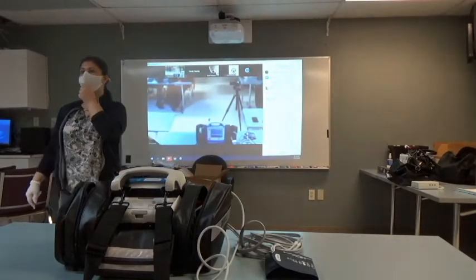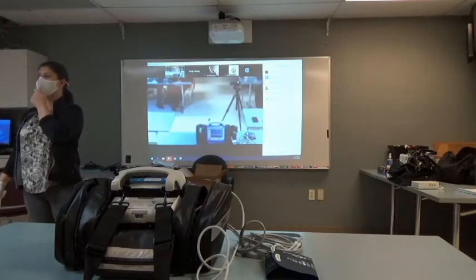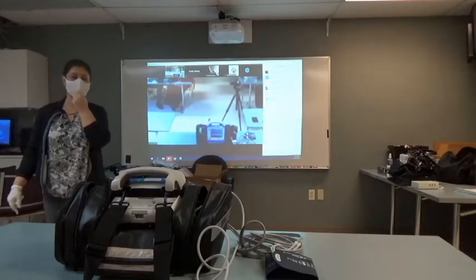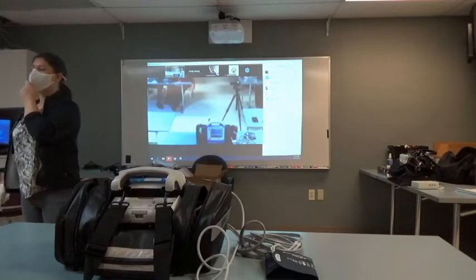Do you guys have any long transport times? No, not really. No? So no need for auto BPs. We'll still do that anyway. Yeah. Still do it? We do, yeah. Okay. Anything you can highlight blue, there's something you can do.